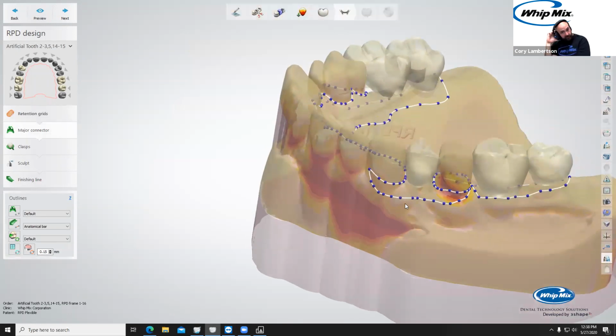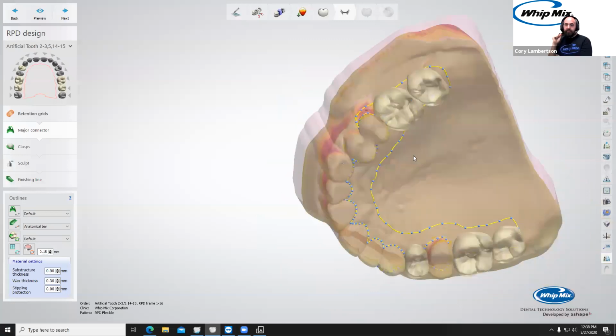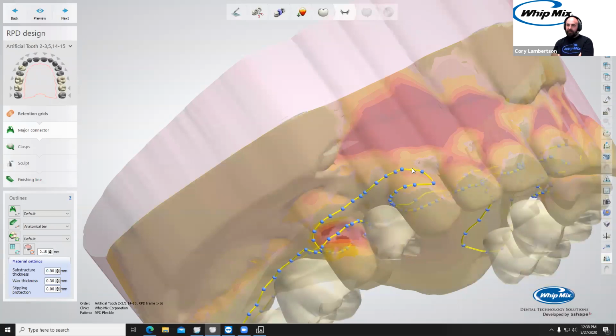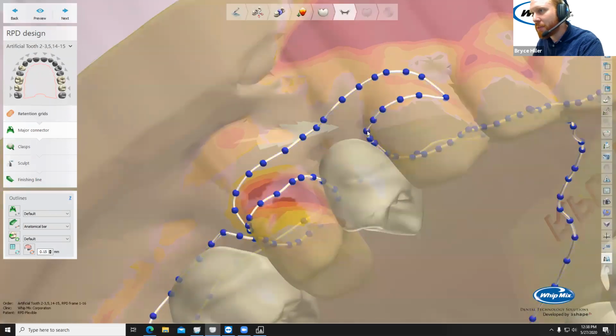Or you design one of these, because I've designed a couple and then 3D printed them, and it looked nothing like what I expected it to. You saw that going differently in your head. Yeah, you're like, man, this looks really good on the screen, and then after you 3D print it, you're like, well, that did not work. Yeah, I've done that a time or two. But honestly, that's part of the learning process.